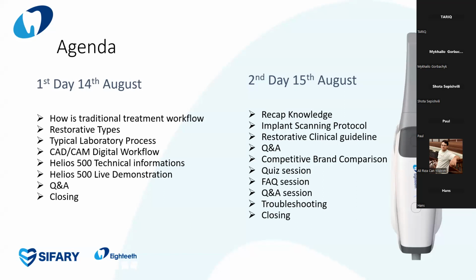And for the sales part, we are going to lecture on competitive brand comparison with other brands of intraoral scanners, where we are and how we compare. At the end of the sessions, I'm going to explain troubleshooting. What could you do if you connect via TeamViewer or AnyDesk, or any type of remote control application? There are some things you can do in order to diagnose the problem. And then we are going to close the session.